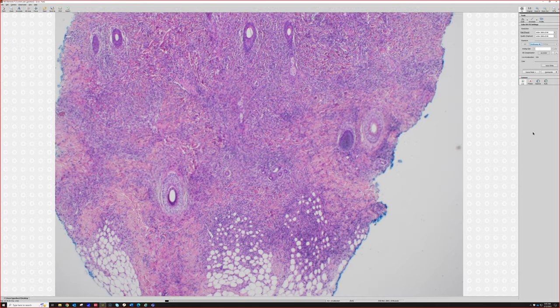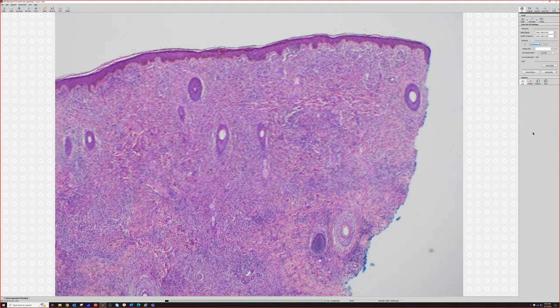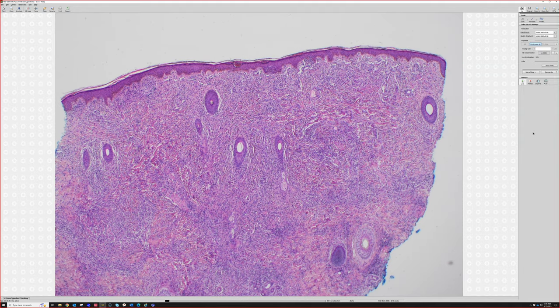So it's hard. Sometimes at 2x I'm right and I can get a subtle diagnosis, and sometimes I'm spectacularly wrong from 2x, which is why I don't just have a 2x objective on my scope. Maybe some people are good enough to get them all at 2x, but I usually like to go closer to confirm. But I always try at 2x. It's a great way to train your eye. It's a great way to realize things that can mimic each other that you might not think of otherwise. Okay?